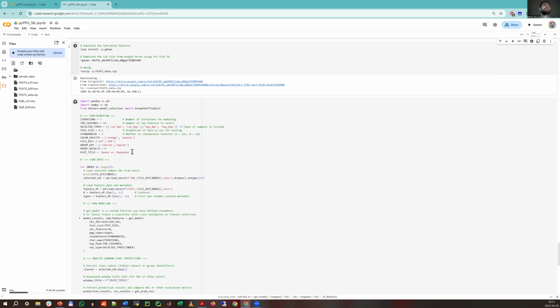Here you can configure. I defined just 3 iterations because this evaluation takes lots of time, but if you want you can define much more, 10, 20, or even more than 100 or 1,000. You're not going to see a significant difference above 20 iterations.